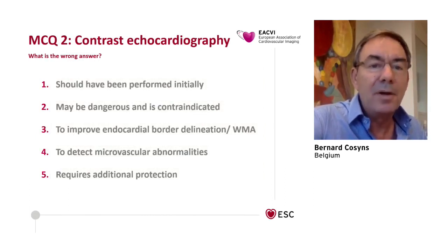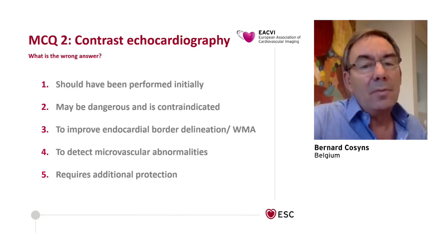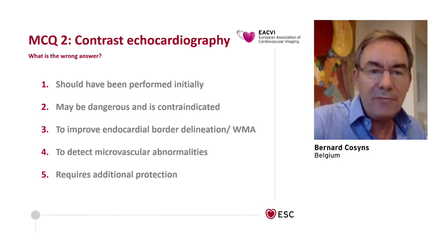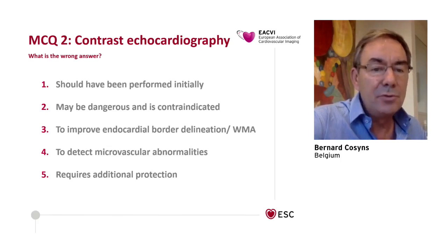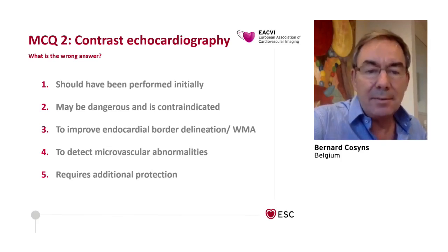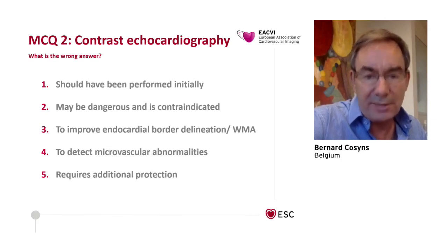questions. So you can also vote for these questions. In this particular questionnaire, there is one wrong answer. And so my questions are the following. First, contrast echocardiography should have been performed initially. Second, it may be dangerous and is contraindicated. Third, it may be used to improve the endocardial border delineation and better assess the wall motion abnormalities. Four, to detect microvascular disease, it could also be useful. And finally, contrast echo may require additional protection.